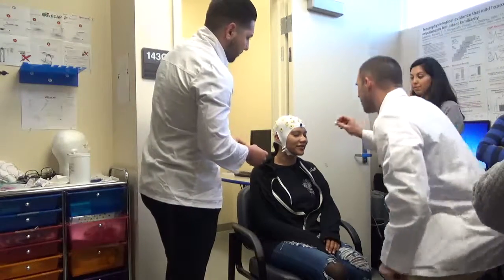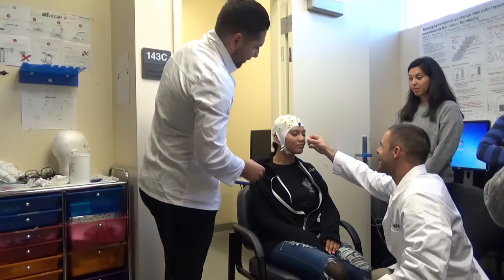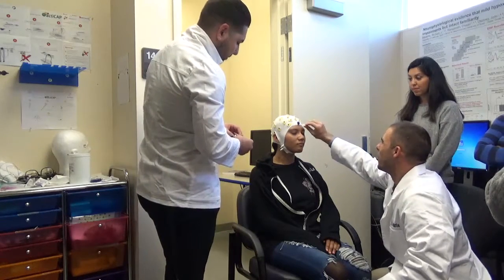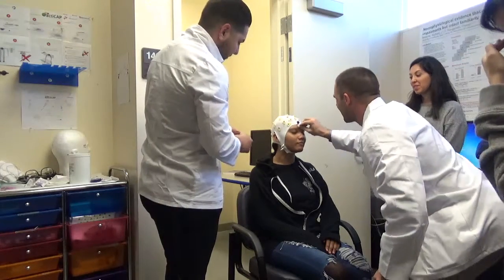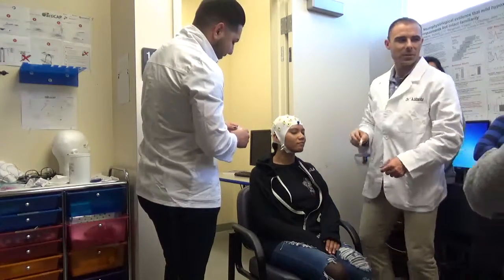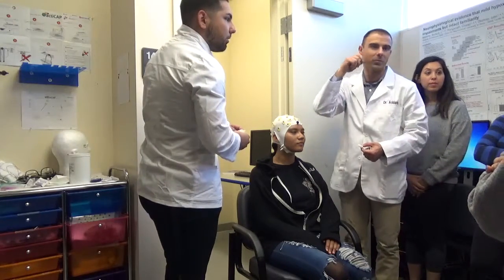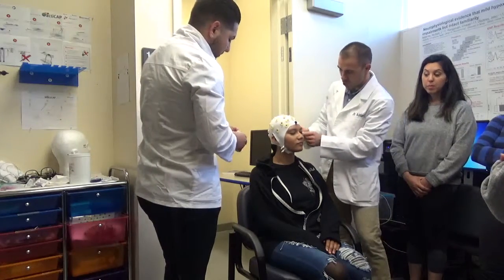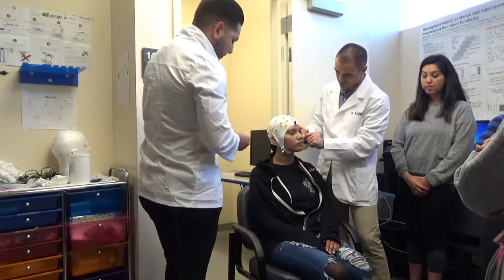So you do want to tell them, I'm going to swab off your cheek, okay? So keep your eyes closed. We're going to torture you now. No, we're not going to torture you. Why can't they do it themselves? Because they can't see. Even with their eyes open in a mirror? They can't see where. Well, we don't really have a mirror handy. I prefer not to. Yeah, and honestly, you know where you're going to put the electrodes and they don't. And it's just a little bit easier.